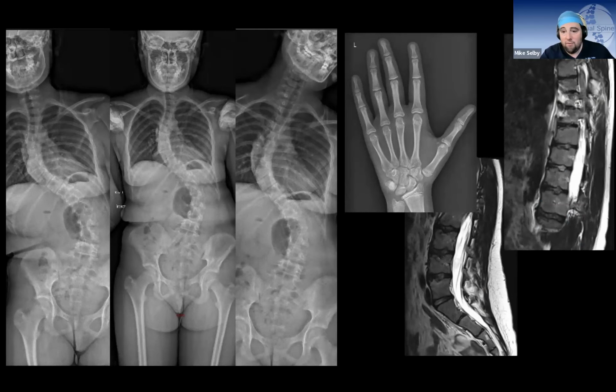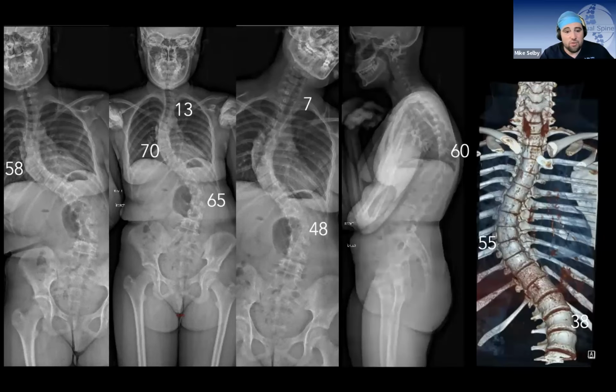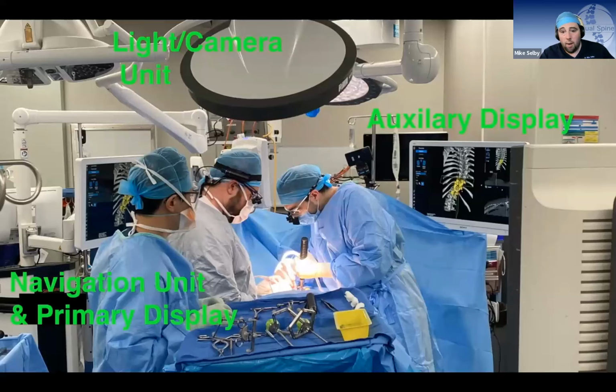Now, with what I did, I may well be doing that as well, but I thought I'd at least give it a go. I've become fairly adventurous with tethering type procedures over the years. And I know that tethering is not going to deal with that kyphosis in the thoracic spine. So we've been looking at the hybrid concept of the thoracic fusion. This is our setup for a fusion procedure for the thoracic spine.